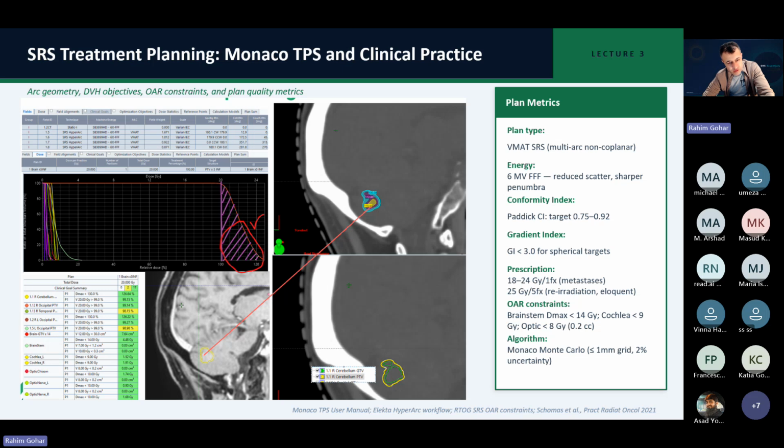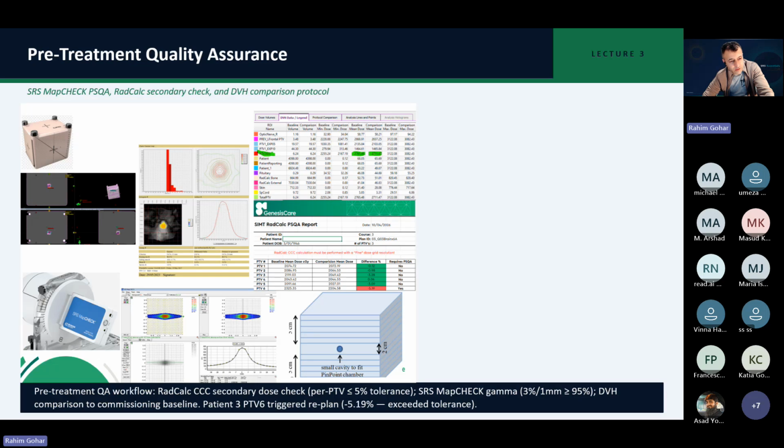And as I mentioned, there are normally GTVs which are visible and high risk. We make sure that this is happening here. If the hot spot is really happening somewhere here, where there is really an OAR sitting, and the risk that you can damage it is very high, therefore sometimes make sure your hot spot is sitting inside. And you must have the built-in templates so that you can say, oh, I'm fine with it.